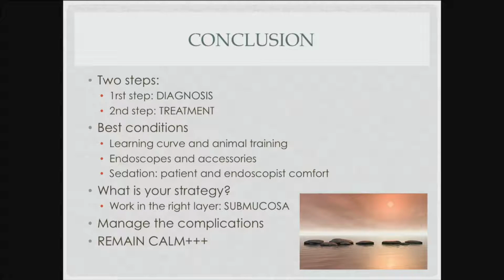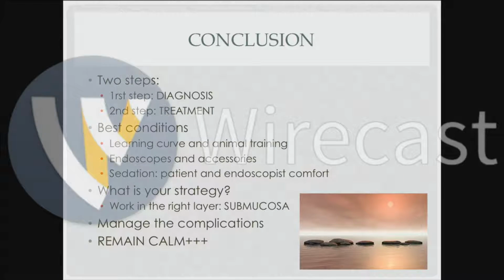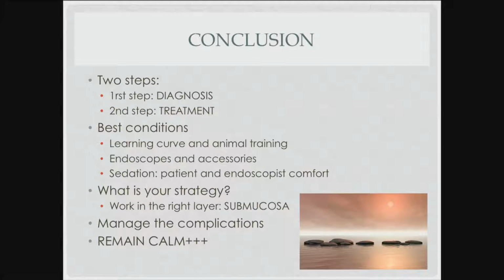I work in Kobe, as I told you, and I would say that if you can, but of course many experts here can answer, begin in the stomach or the rectal cases, because we know that for complications in the lower rectal cases, even if you have a perforation, in 100% of cases the evolution is good with medical treatment, so it's quite safe. And we know that in the stomach, the wall is thicker than in the esophagus or a colon lesion.